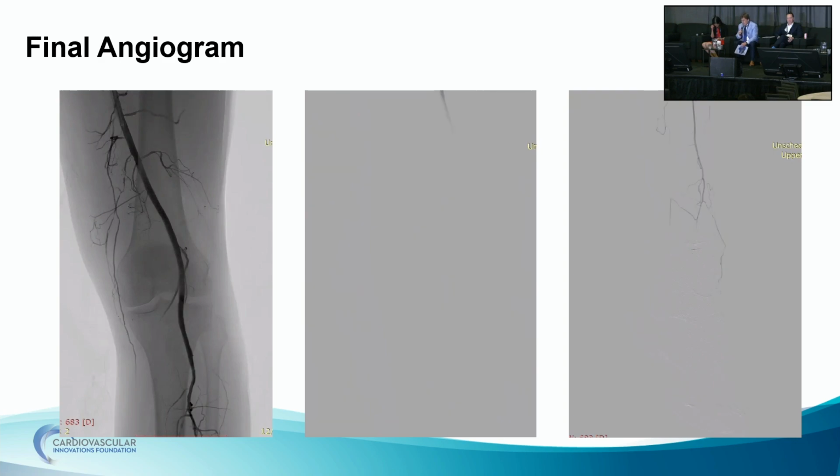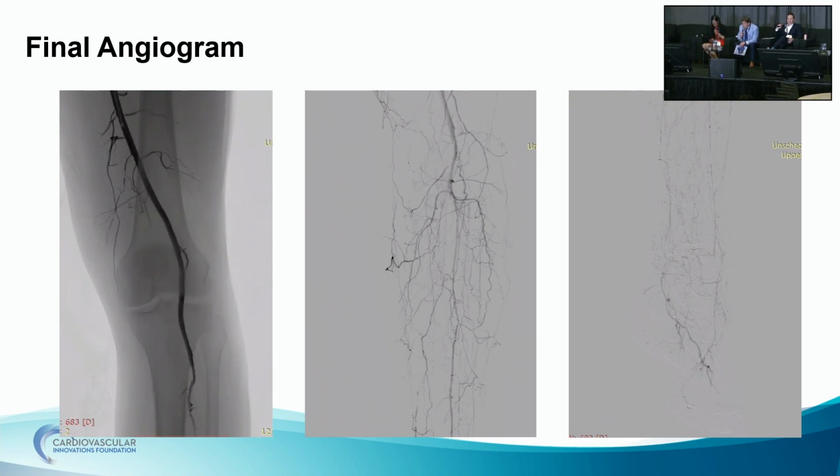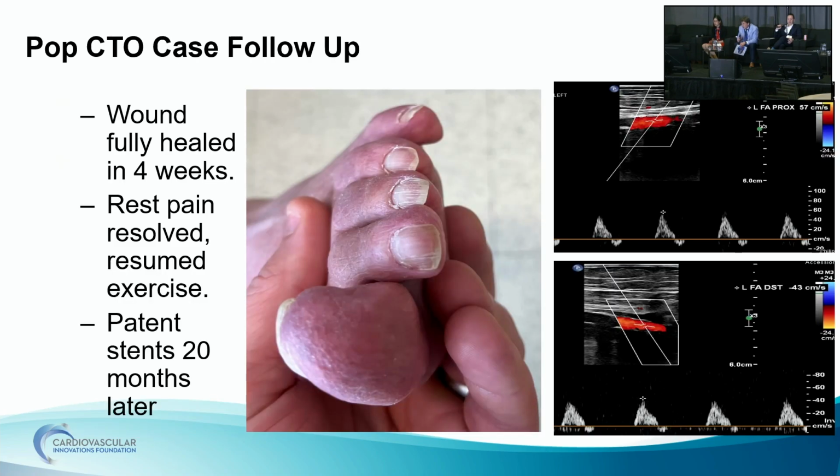I'm not sure you're not done. I mean, you've got pretty brisk flow. It was a tiny wound to begin with. I think you're done, Herb. I wouldn't deal with that PT. That's going to be a nightmare to go down there and try to recon. You're going to have to get across that whole thing. It's small. It's diffusely diseased. I bet you're fine for now.